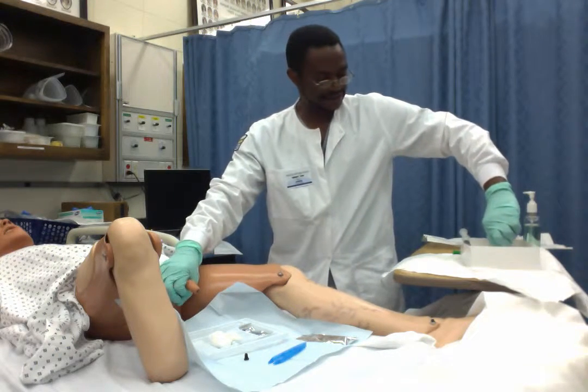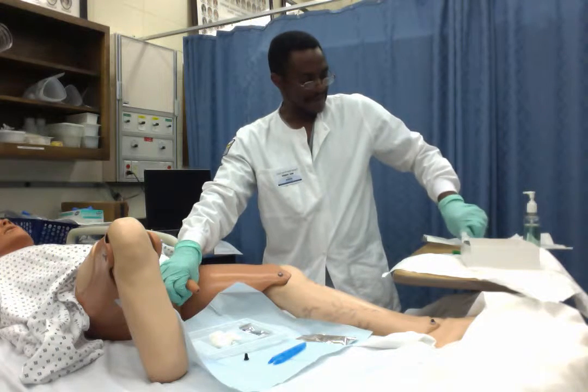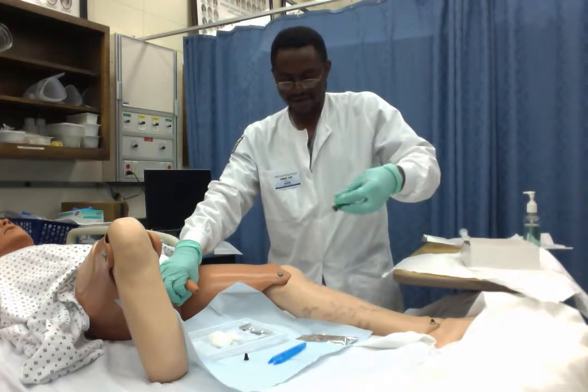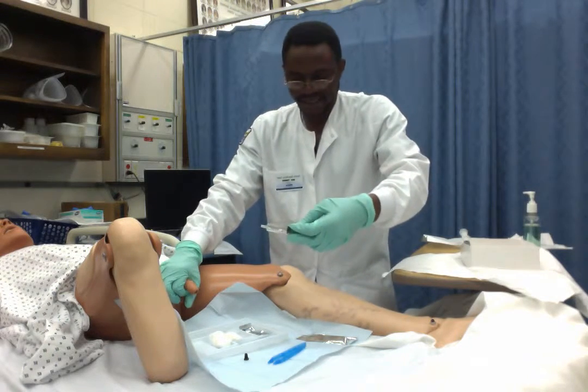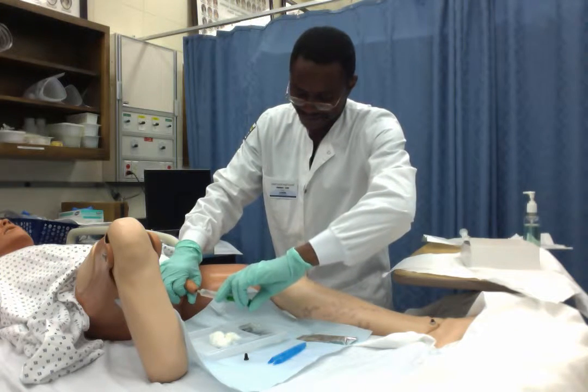Now I can insert my catheter. But before inserting the catheter, I will want to lubricate the urethra of the penis. So I will take my jelly and inject it totally into the urethra.